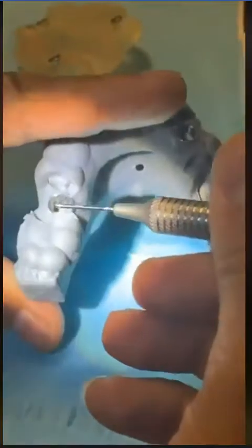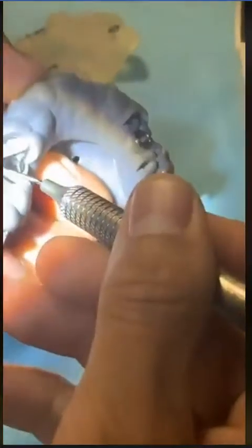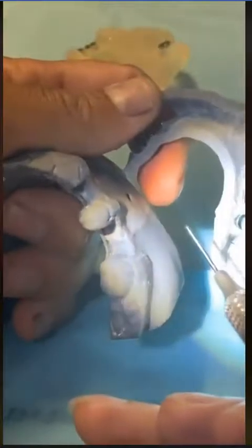Let's look at it on this one. There's no space on that premolar, there's no space over here. If you get a guide that's, let's say, sitting like that, that means there is something holding it up, whether it's inside the guide, or something from the patient's tooth with the undercut that's holding it up.